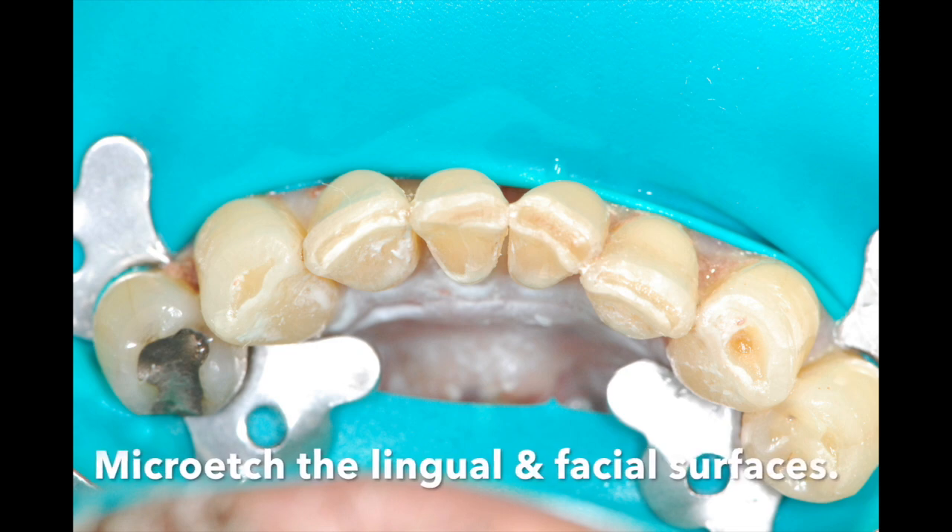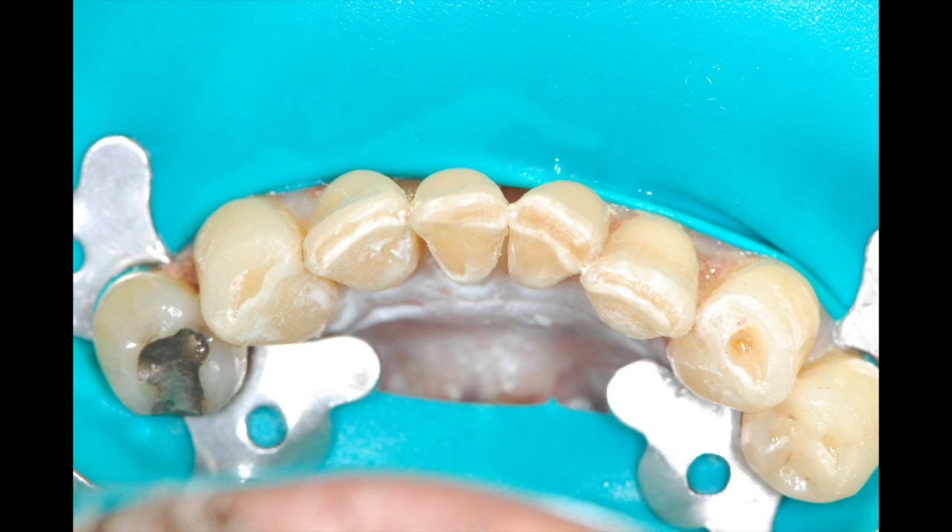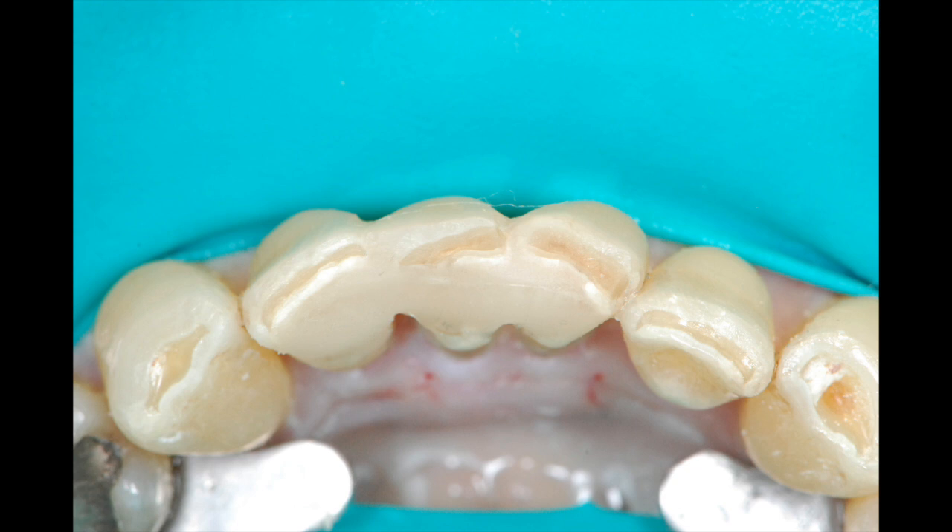To enhance retention, I will often take a micro-etcher and airabrade the lingual surface of the anterior teeth. The teeth are then etched with phosphoric acid and bonded with a 6th generation bonding material.